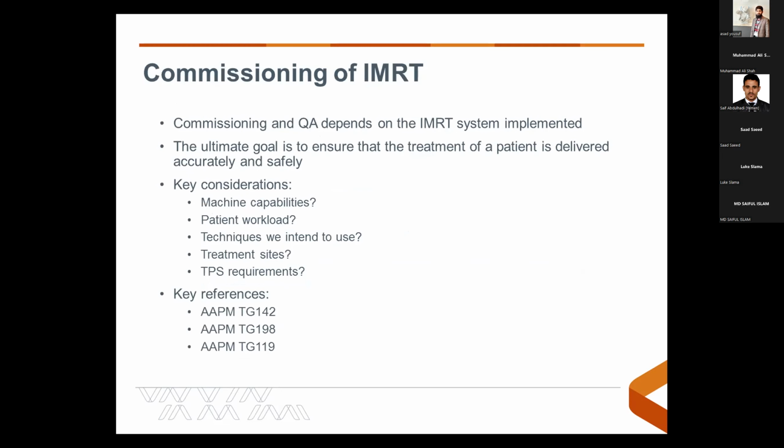So now I'm going to talk a bit about commissioning and QA of IMRT. The commissioning and QA depends on the IMRT system implemented, and the ultimate goal is to ensure that the treatment of a patient is delivered accurately and safely.